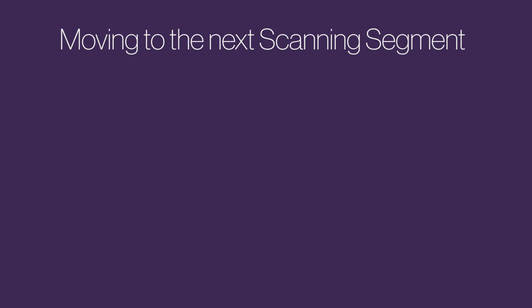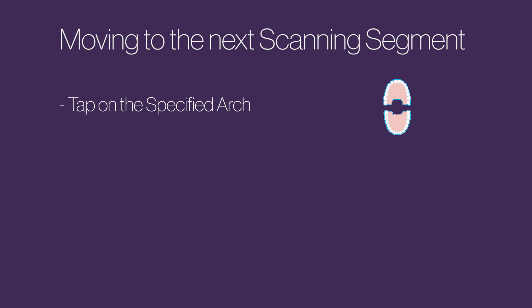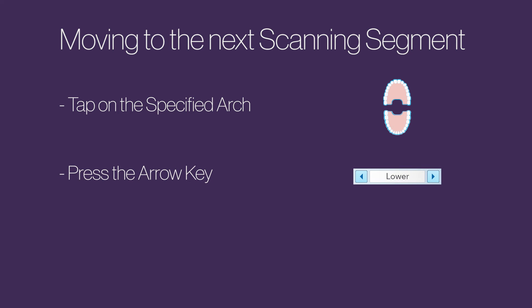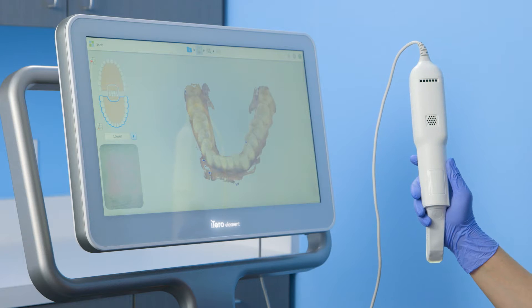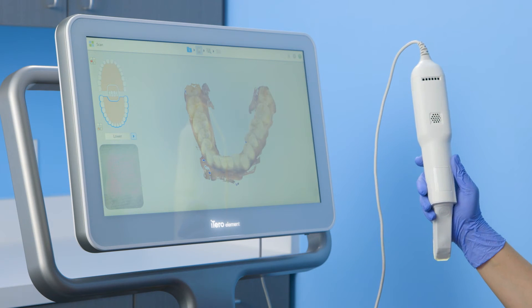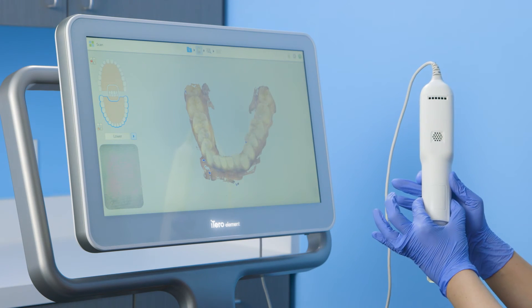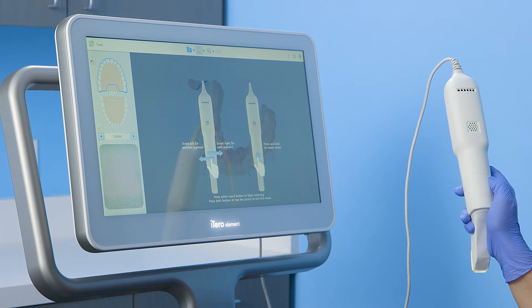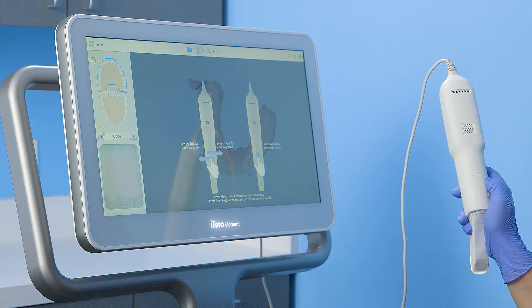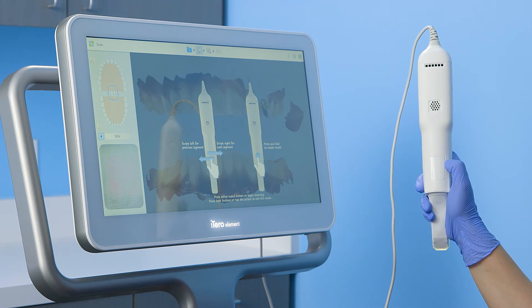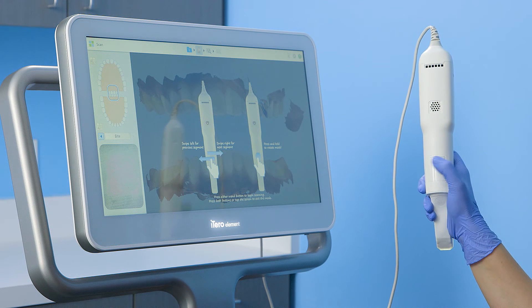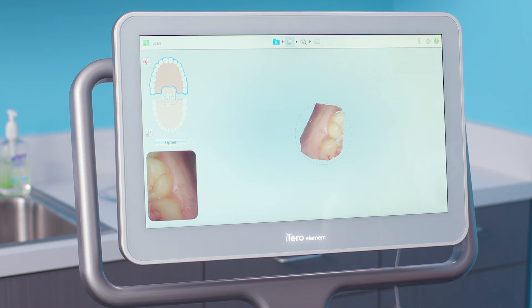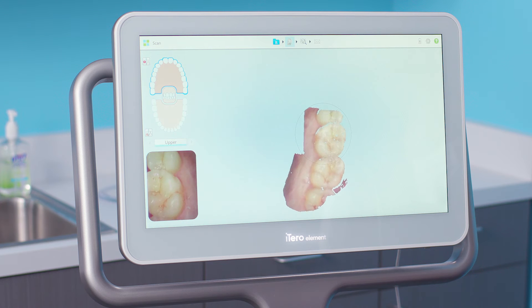To move to the next arch, I have three options: I can tap on the specified arch on the touch screen, press the arrow key on the segment indicator box, or use the touchpad on the wand. To activate the touchpad, I'll press on both wand side buttons simultaneously, release, and then use a steady firm swiping motion from left to right to move to the next segment. To go back to a previous segment, I'll swipe from right to left. I will then use the same scanning sequence and technique to complete the upper arch.